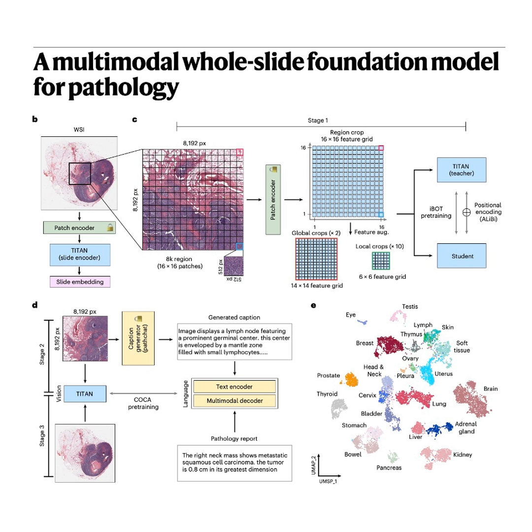I mean, current models are fantastic at analyzing these tiny defined regions of interest, maybe 512 by 512 pixels. Okay. But the actual clinical data, these whole slide images or WSIs, they're gigapixel behemoths. Trying to analyze that massive scale with these old patchwork models is just, well, it's incredibly inefficient. And it's not just the size, right? The constraints go beyond that.